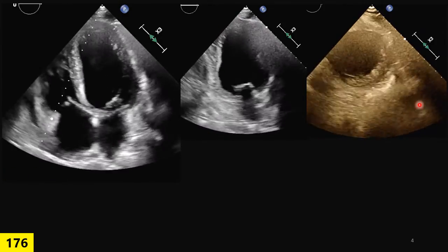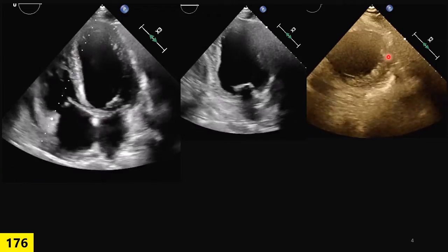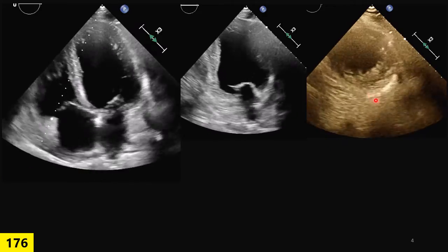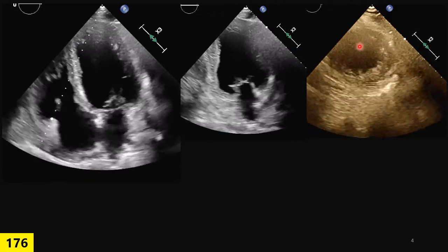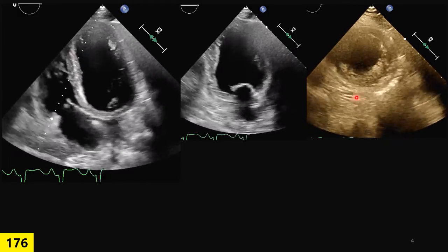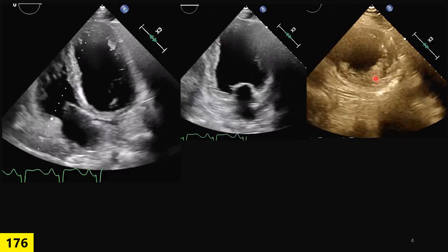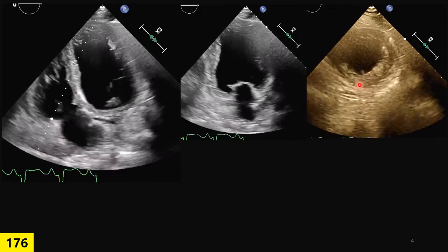Another important principle — as I mentioned in the PSAX transthoracic ECHO lecture — on PSAX you must always survey all the way to the apex and finish there. Move your transducer toward the apex until the image disappears. At this view I noticed something: there is an apex visible, no papillary muscle, but something wrong beyond the wall motion abnormality — there is thickening here.